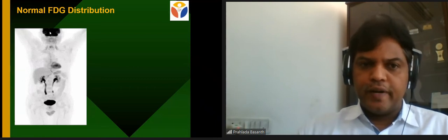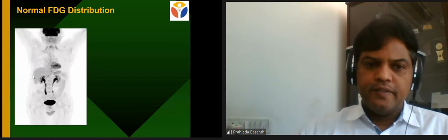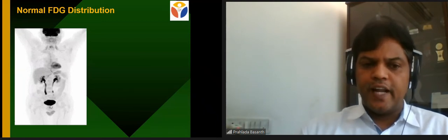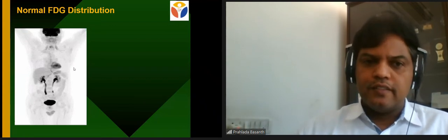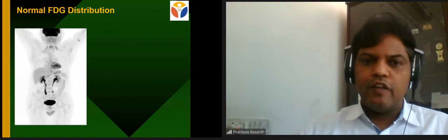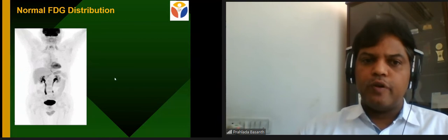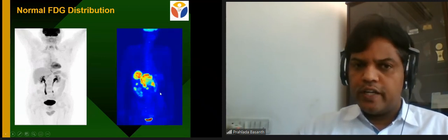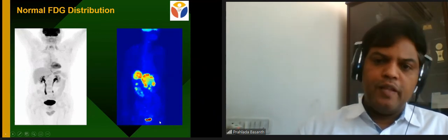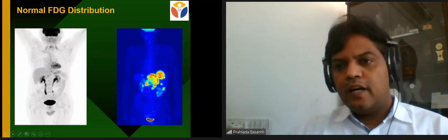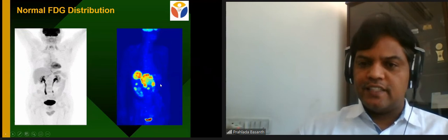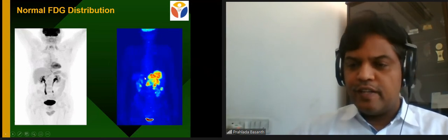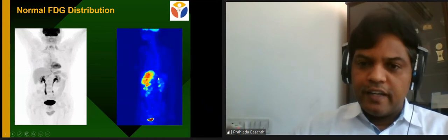Normal FDG distribution shows physiological uptake in the brain, variable uptake in the heart, low uptake in the liver, spleen, and kidneys, and excreted activity in the urinary tract. Muscular exercise can cause muscular uptake, and in young patients brown fat FDG uptake can occur. The MIP (maximum intensity projection) image gives a bird's-eye view of overall distribution. Nuclear medicine images can be displayed in different color scales, unlike CT, which enhances detection of pathological uptake.